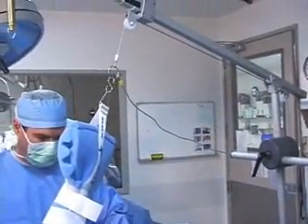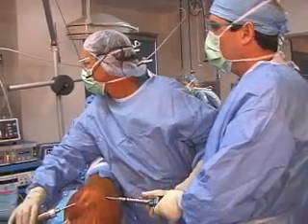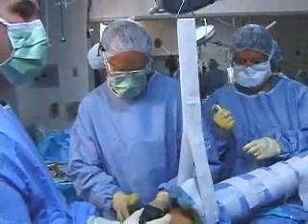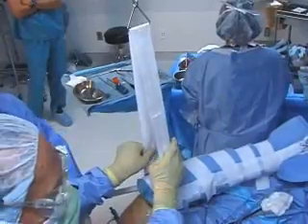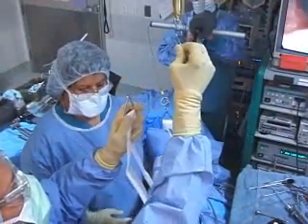There is the normal traction for arthroscopy which is fixed. We have the two-point traction which is the lateral strap. Then we have the third point which is the traveling pulley that gives us infinite adjustability. It's a system that can be used by any shoulder arthroscopist as they get more comfortable and sophisticated in their reconstructions. They can fine-tune the position of the arm, adding a little bit of traction, a little bit of counter traction, rotating the arm. You can have the best scope in the world but if you can't position the arm in the optimal position to do your operation, you can't do the type of surgery that you want to do.